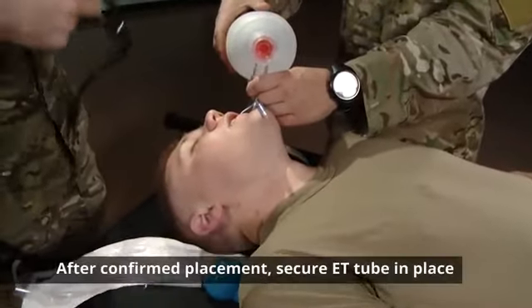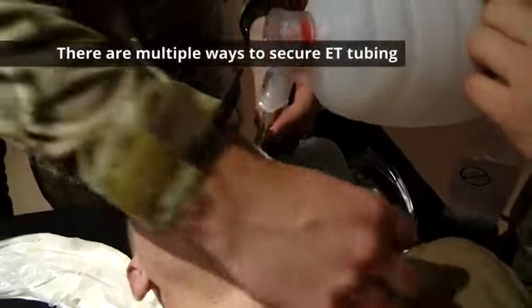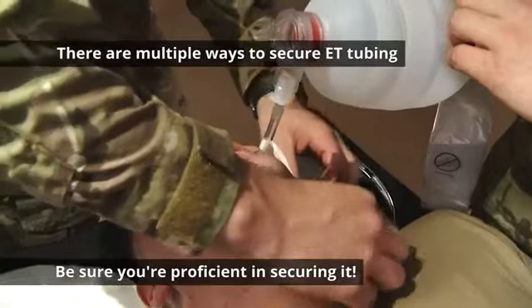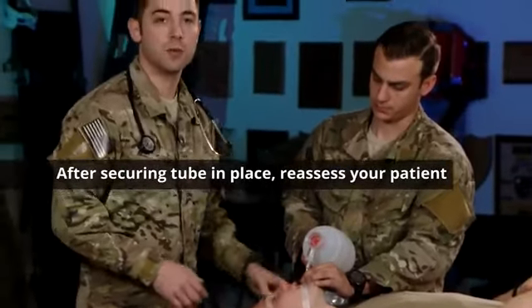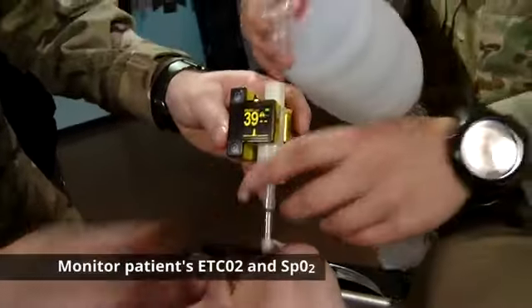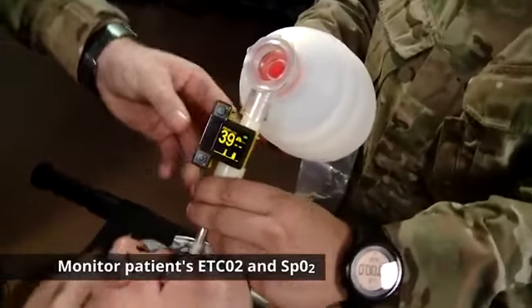After you've confirmed placement, make sure you secure your ET tube in place. Remember, there are multiple ways to secure the ET tube, but no matter which one you use, make sure you're proficient in securing it. After you secure your tube in place, reassess your patient, and if you have waveform capnography, apply it to confirm placement and monitor your patient's end-tidal CO2. Also, monitor your SpO2.